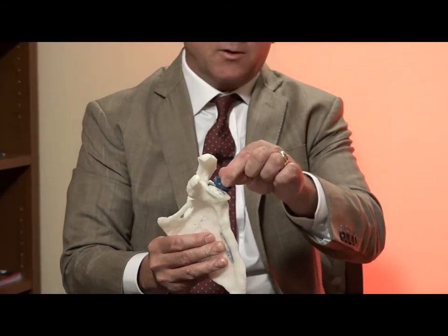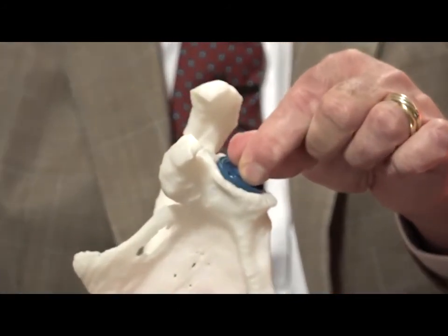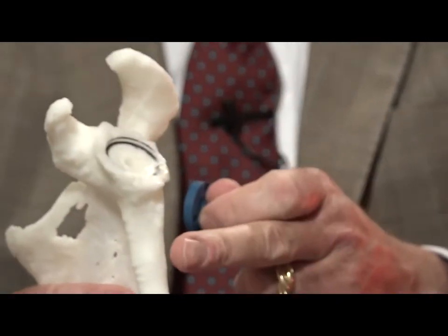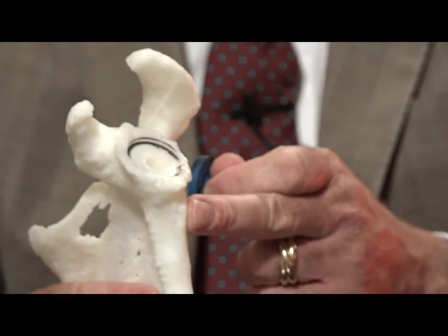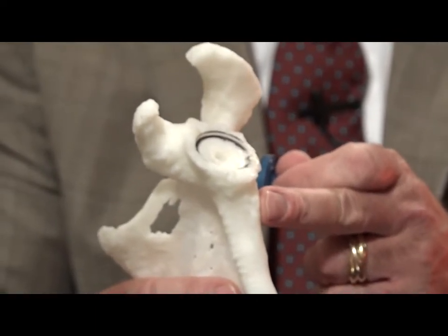This problem is solved with an inset glenoid because the glenoid doesn't sit on the surface. The implant sits partially within the bone, like a manhole cover, surrounded by a peripheral rim of strong sclerotic bone. And our literature shows that this provides up to 40 times increase in glenoid fixation strength.